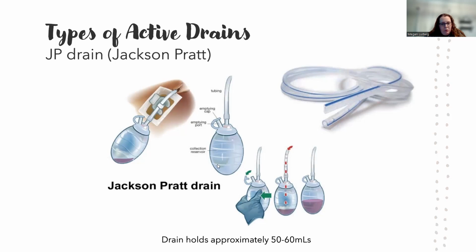Because if you happen to need to empty this before the patient leaves the room, you need to, A, let your surgeon know that it's already filled, okay? And B, record how much you have emptied. That's going to need to go in the record, and the surgeon's going to want to know how much. So if maybe this is full before you leave the operating room, the surgeon may need to actually go back in and see what's bleeding so much.